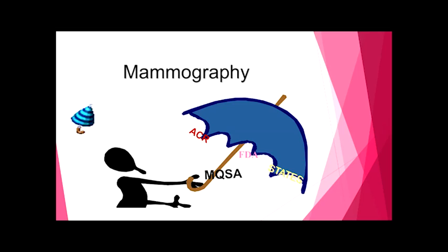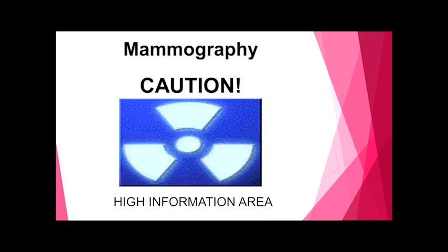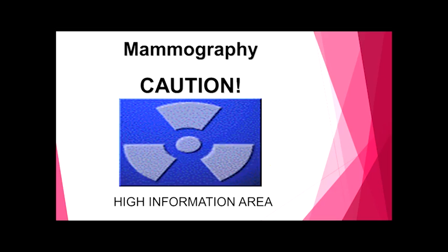It's an umbrella now where there's a multitude of regulations that have to be met to be able to continue to perform mammography. So I always like to say caution, this is a high information area, because what we're providing is information about the overall program and some of the fundamental parts of it.